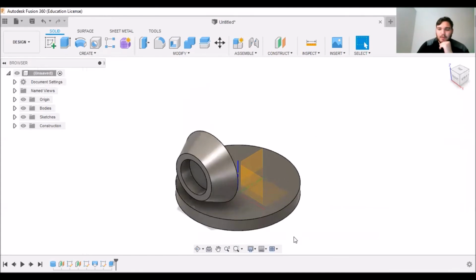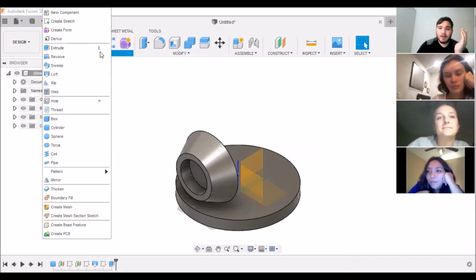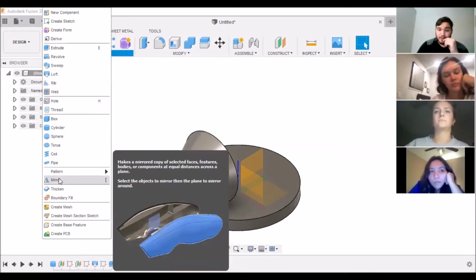So now we want to create an entire cap on the other side, right? Do we just start completely over, do the same exact motions one-on-one? Is that wise? No. You already did the hard work. Let's utilize that hard work. If you go underneath the create window again, you can have mirror.